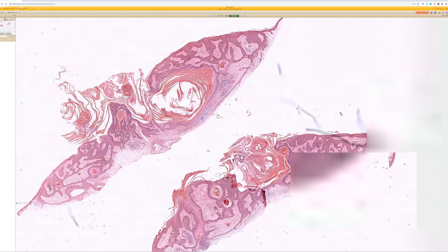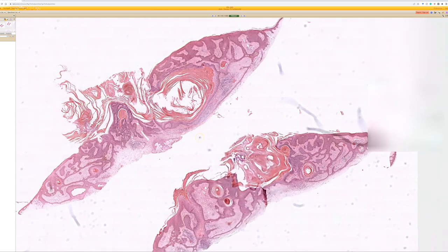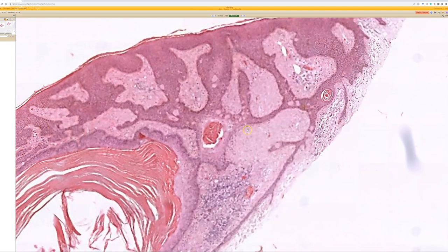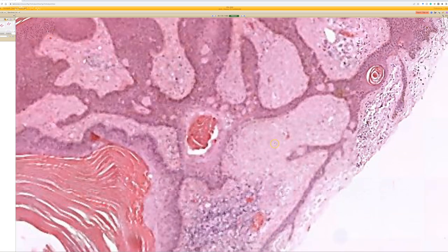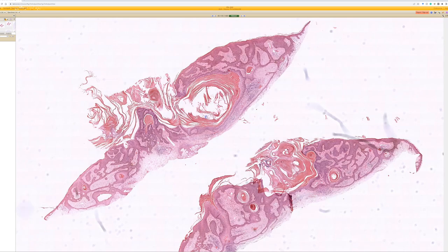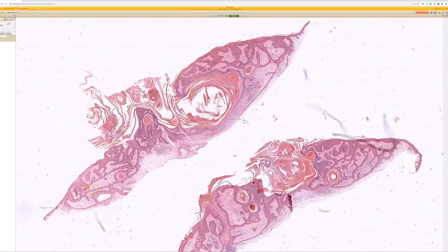At low power we see some hyperkeratosis, some acanthosis, and what looks to be a reticular formation of a seborrheic keratosis. And then if we go in at low power — yes, from low power like you said it looks like a perfect seborrheic keratosis: acanthosis, interconnected strands of keratinocytes with some increased pigment and nice beautiful horn pseudocysts that you can see in some areas opening to the surface.